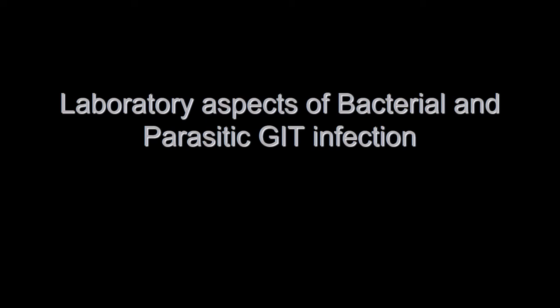And here we need to talk about how to collect a specimen, the nature of the specimen, and the information that you can get out of what we call simply a stool analysis, then microscopy, and then in bacteria, usually we culture.